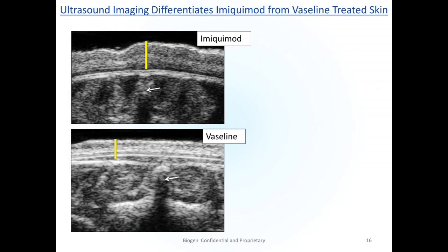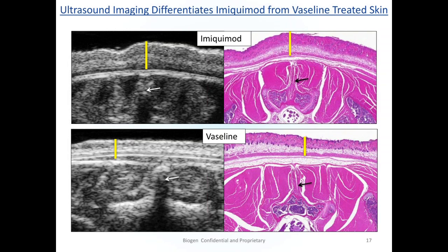Again, we did a side-by-side comparison with the histology to try to interpret what's going on here. So lining up again with the spine, we felt that these extended regions, these thickened areas, corresponded to thickening in the epidermis, dermis, and even in this adventitial layer below.